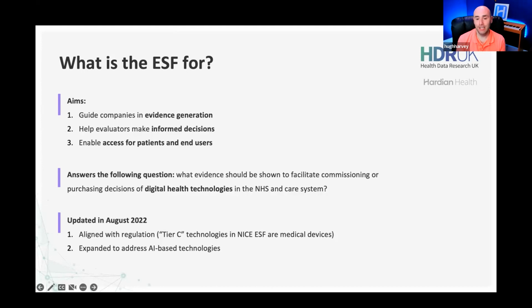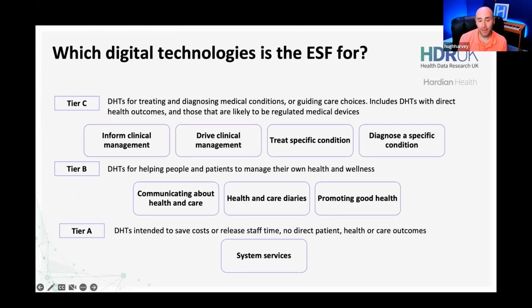So as I mentioned, tier C technologies in the NICE ESF are medical devices. So these are class 2 and above software as a medical device, and that includes AI devices, because as per your intended use, they are intended to either inform clinical management, drive clinical management, treat or diagnose a specific condition.